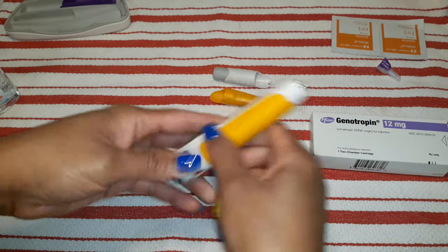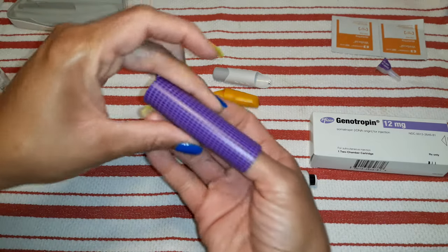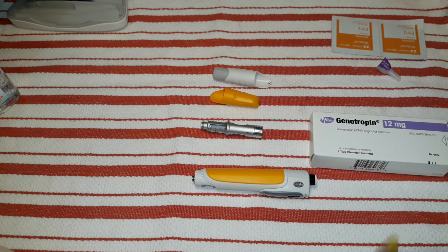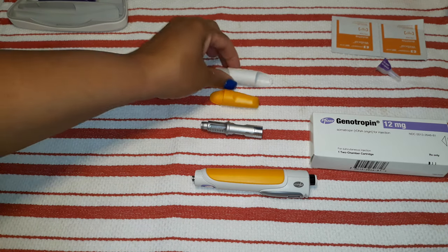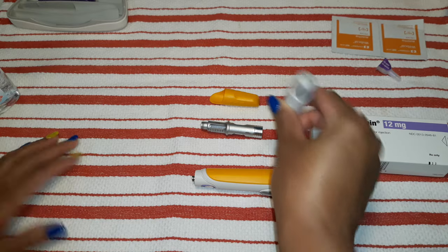Y'all, I have nails, so I can't take that off right now. But you can change the casing — they send you an extra one and a cap, depending on who your doctor is. And then there's the top for when you're actually giving the shot.